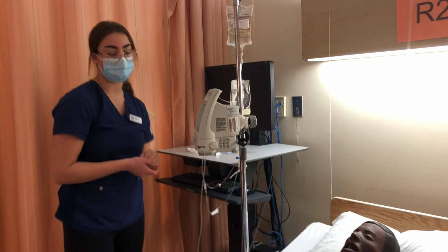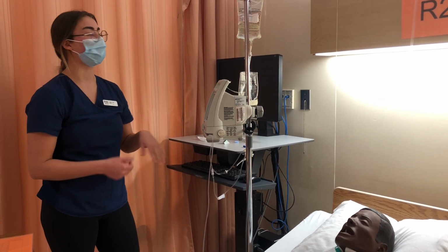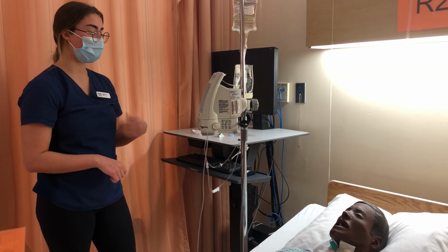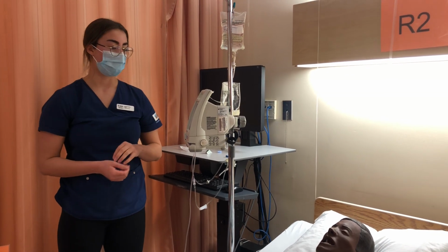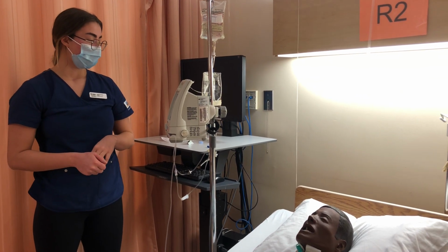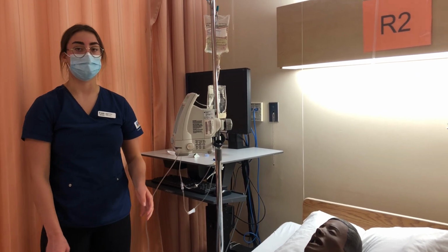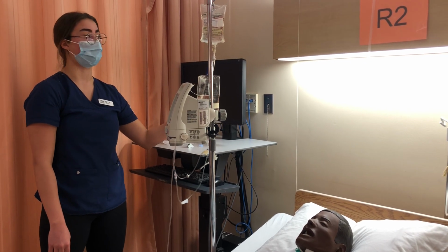I'll be back in about 15 minutes to assess you for any side effects and to make sure that my line is still running at the correct rate. Once I'm done that, I'll come back in an hour once this entire bag has been given, and I will program a 15cc flush to make sure that the entire medication dose has been given. I will also make sure that the primary bag starts to run after that.